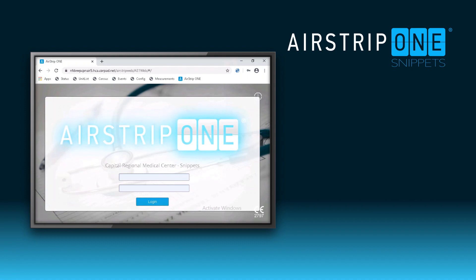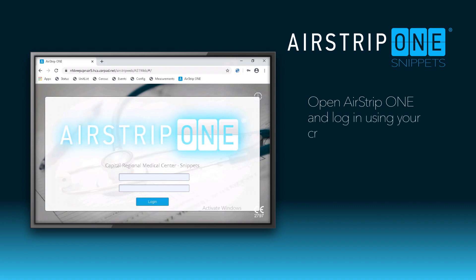Creating EKG strips or snippets using Airstrip 1. Both monitor techs and nurses can create snippets using Airstrip 1.